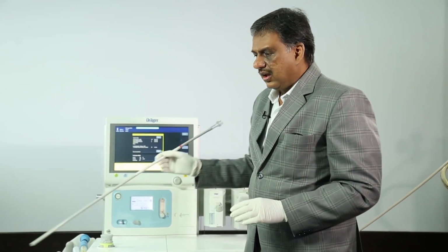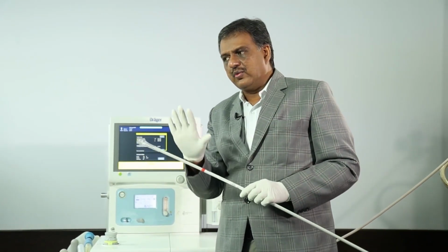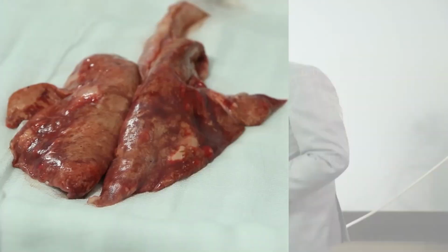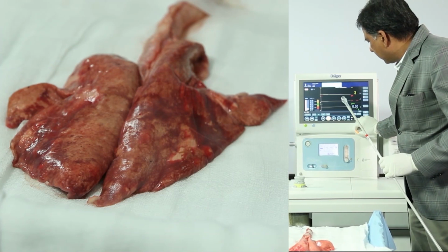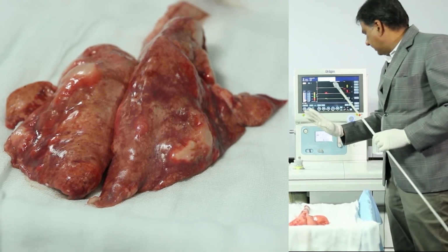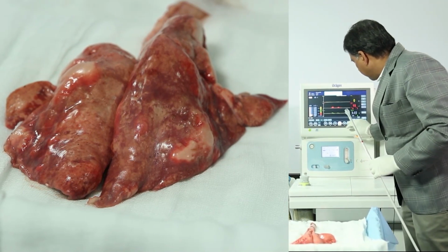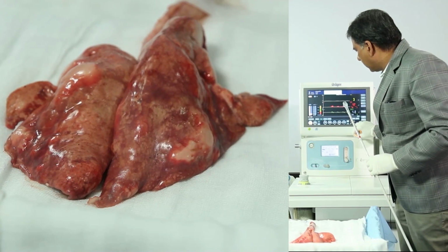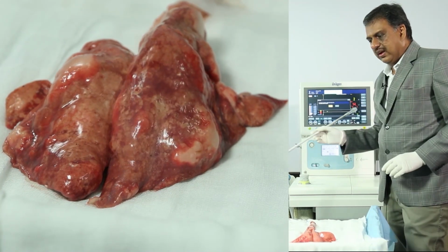We have a goat lung cadaver, and I am going to set the ventilator as per traditional setting: volume control ventilation, tidal volume 300, presuming a goat weight of 30 kg at 10 ml per kg, respiratory rate 12 and PEEP 0, and FiO2 at 50. Look at the lung.